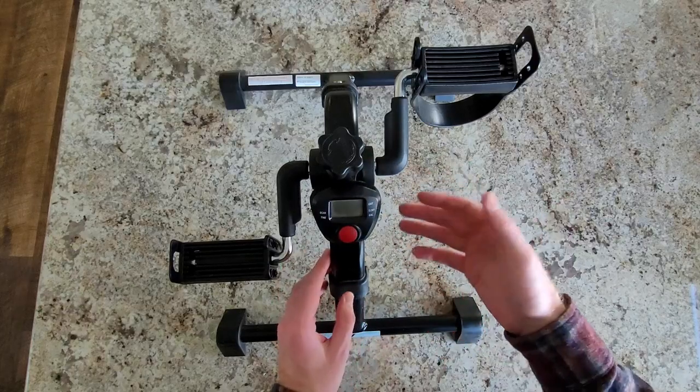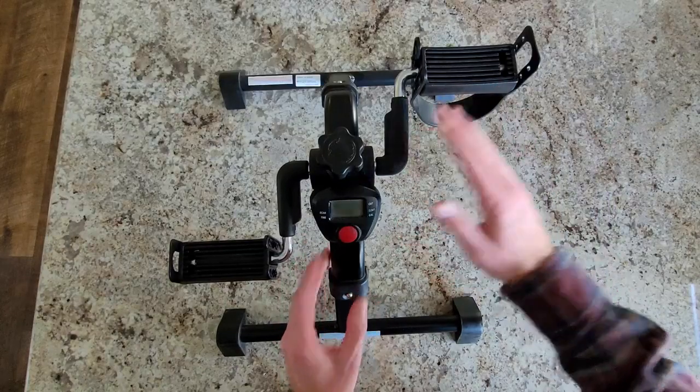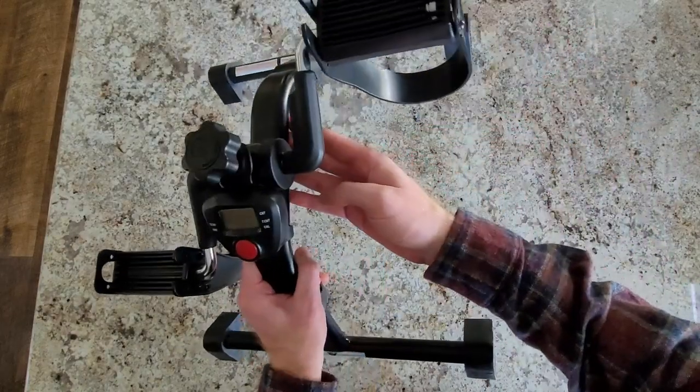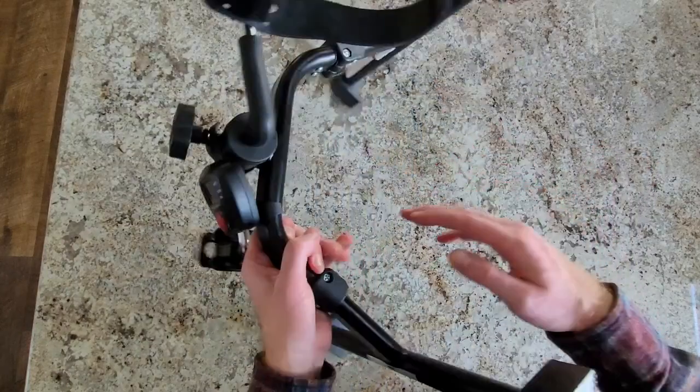Hey, it's Philip, and I'm going to be talking about and telling you all about this pedal machine, how it works. Starting off, this is it — a good size. It's not too big, and it can fold in as well, so it can be very compact if you need to travel anywhere.